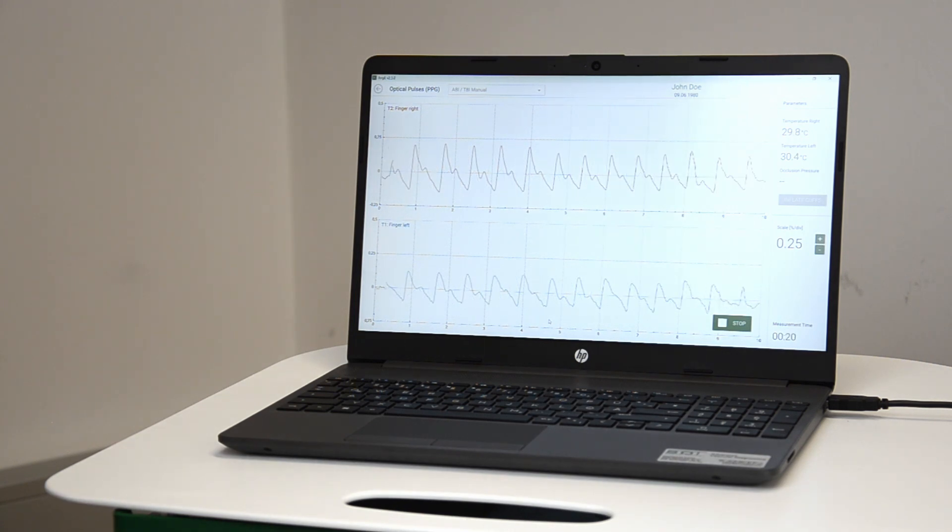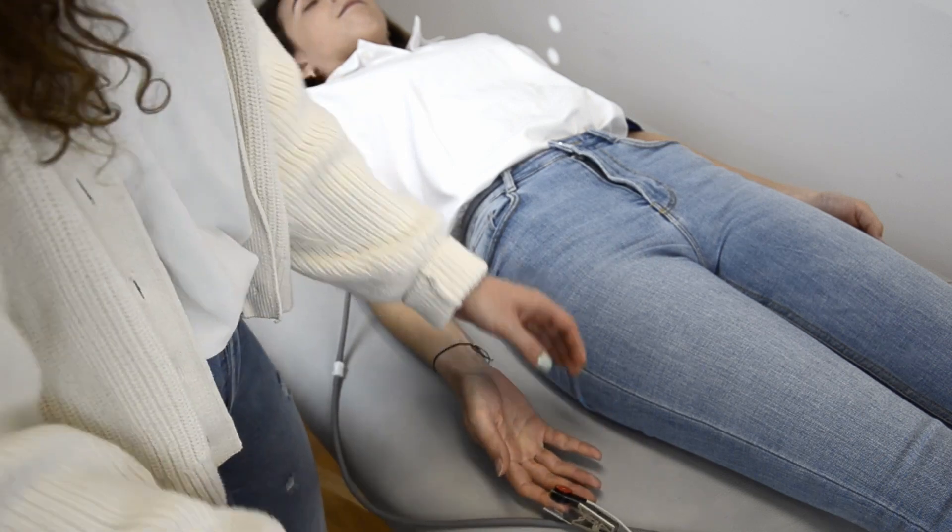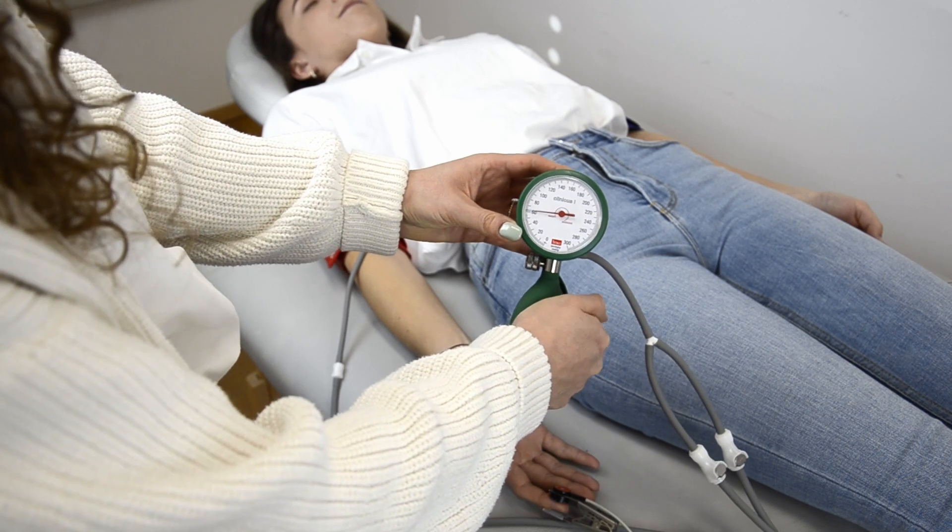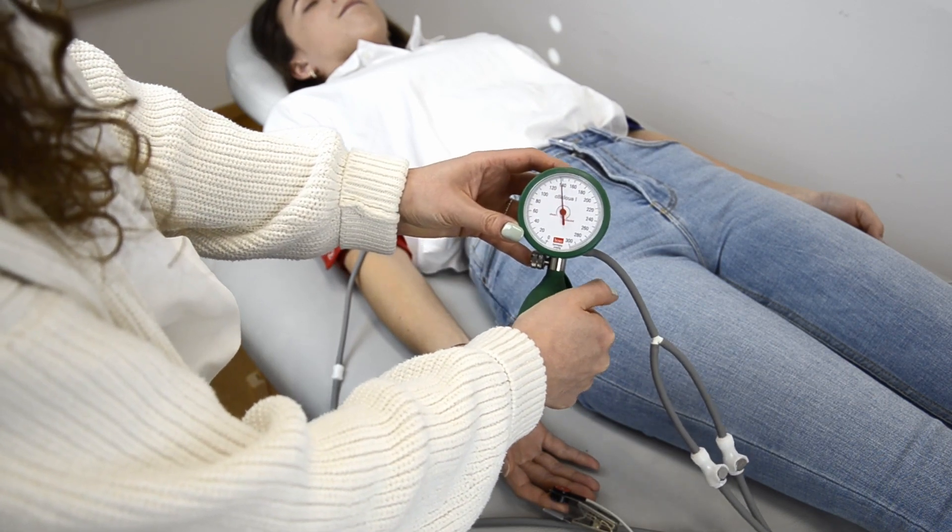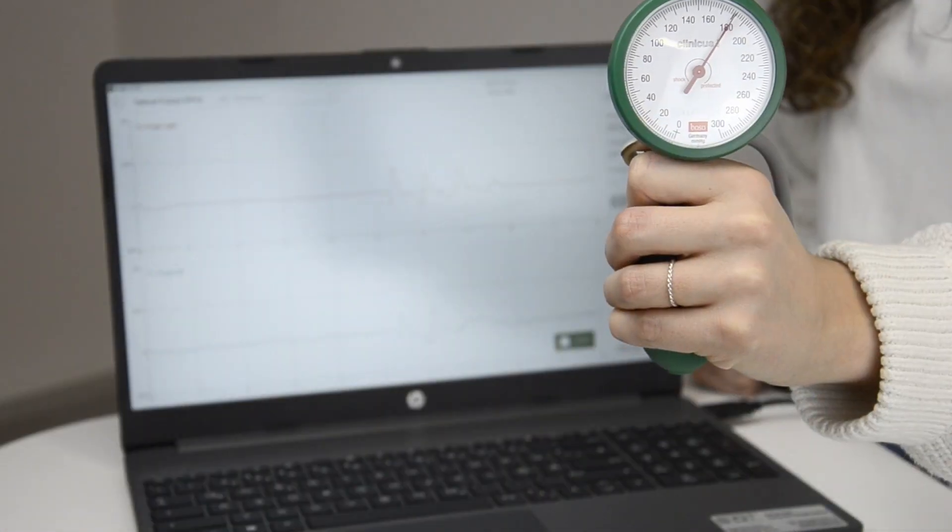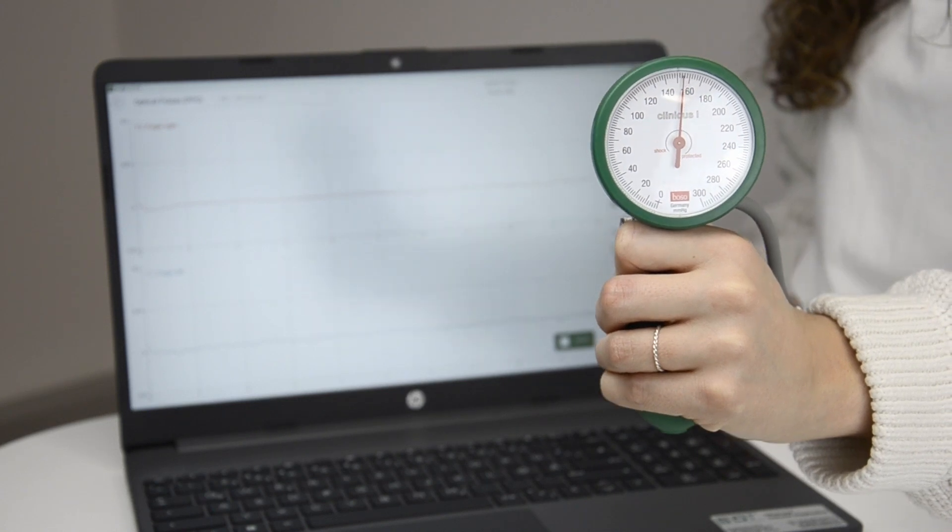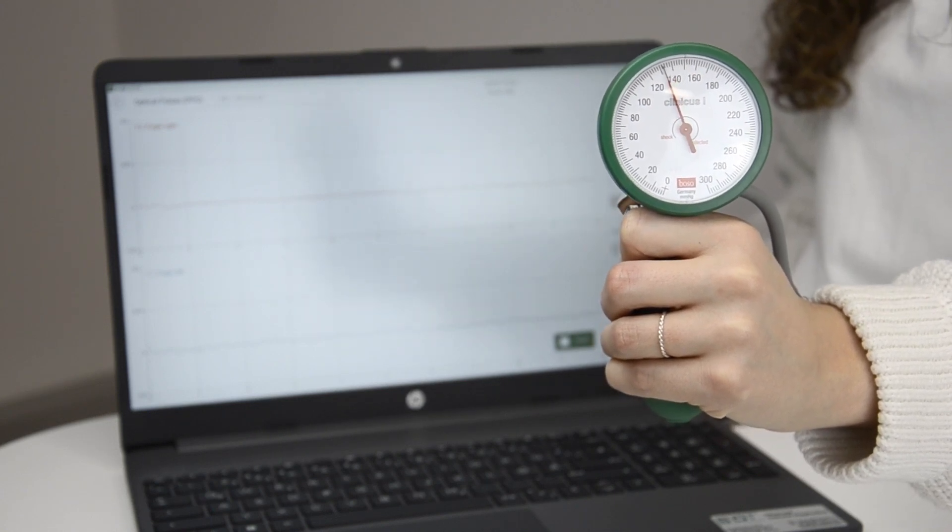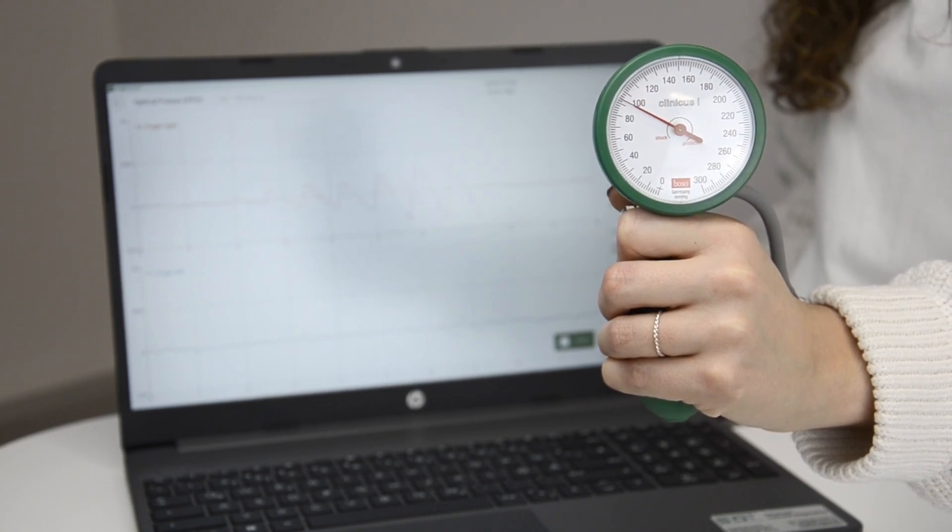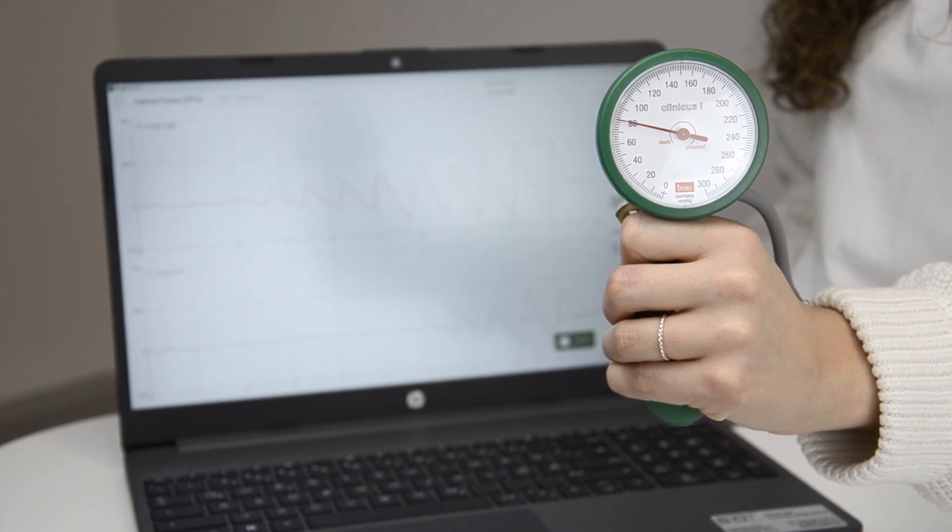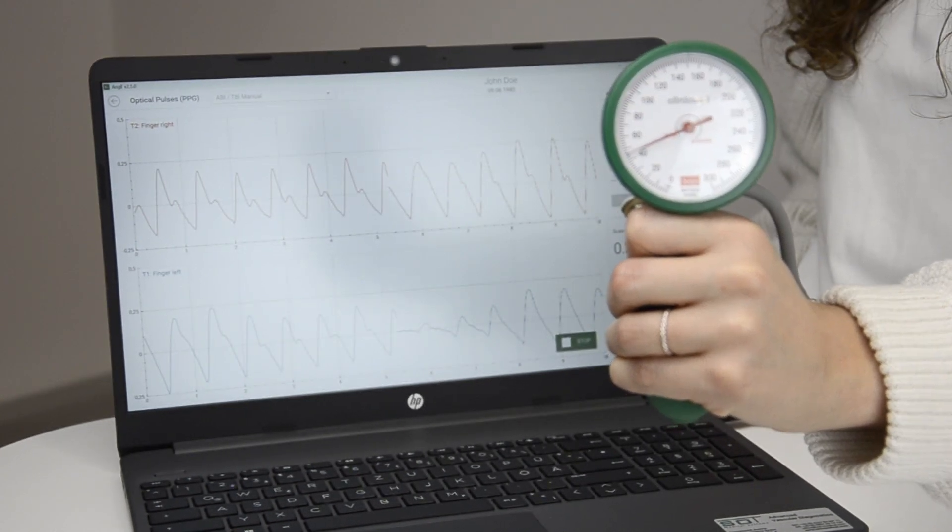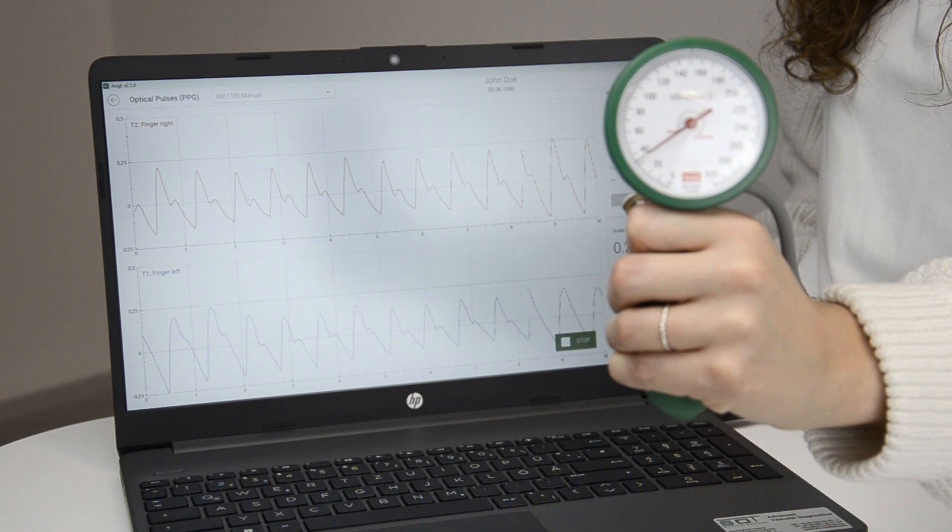Now you can start to apply the cuff pressure. Apply pressure in the cuffs using the hand pump. Increase the cuff pressure until the pulse waves disappear and the flat line is displayed. Release the cuff pressure slowly. Observe the manometer and note the pressure at which the first pulse waves reappear. If you are unsure about the recorded pressure, simply pump the cuff up again and release slowly to recheck the result. The pressures have to be noted for the left and right side individually.